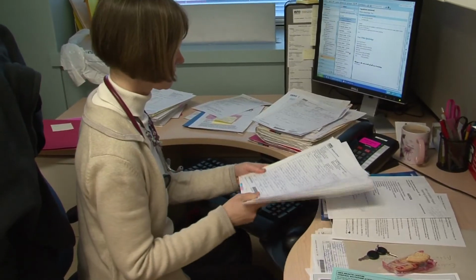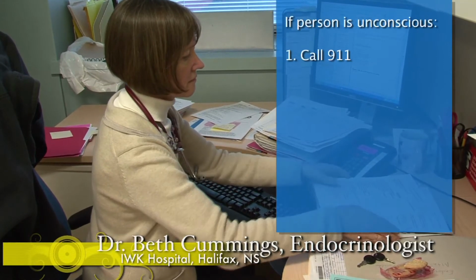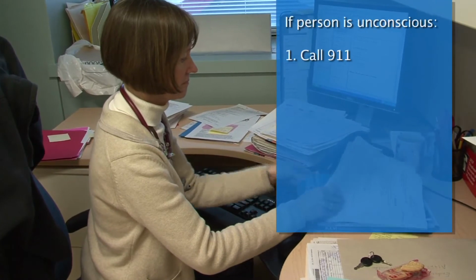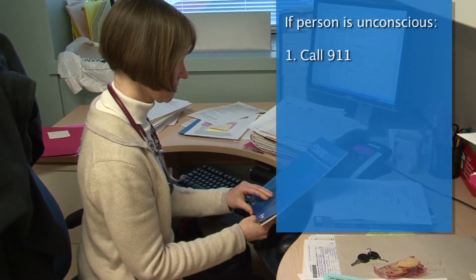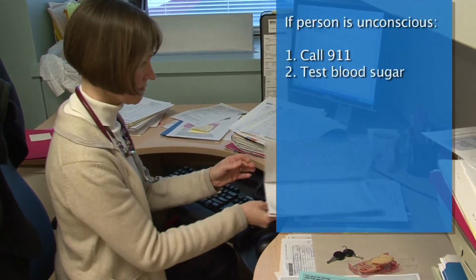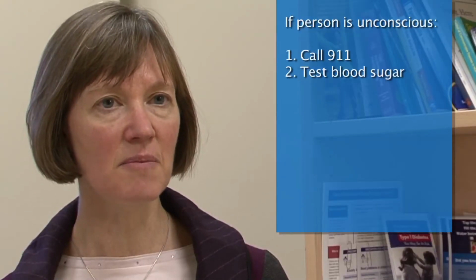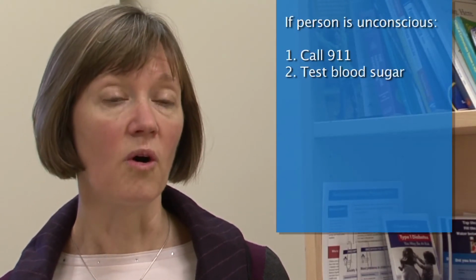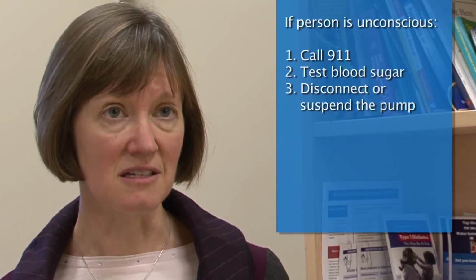If you come across a person who's unconscious, the first step is always to activate emergency health services, call 911. Then with a pump, just like anyone with diabetes, the problem may be a low blood sugar. So if you have access to a blood sugar testing meter, a glucose meter, test the blood sugar. If the blood sugar is under 4, that's a low blood sugar and needs to be treated. Then the next step is to disconnect the pump, either disconnect it at the site or suspend the pump. Best thing is to disconnect it.